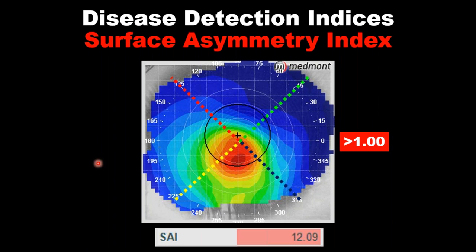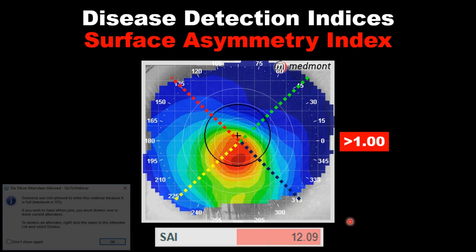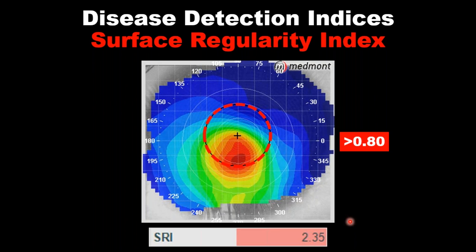When the Surface Asymmetry Index is greater than 1, that would be considered an irregular cornea — and this patient is coming up as 12, so it's very asymmetric. La medida científica nos dice que cuando ese índice de asimetría de la superficie es mayor de 1, es indicativo de una córnea anormal o irregular. En el caso que tenemos, ese índice fue de 12.9, indicando una severidad bastante grande.